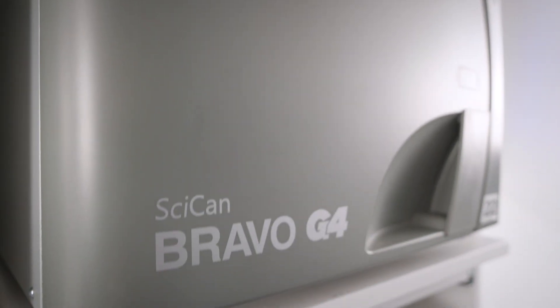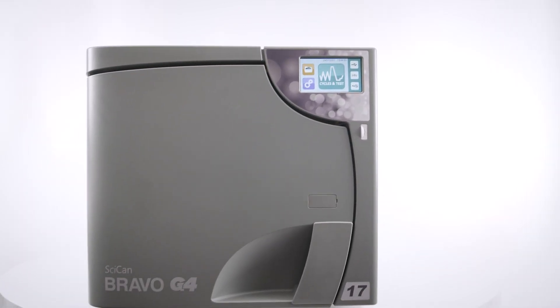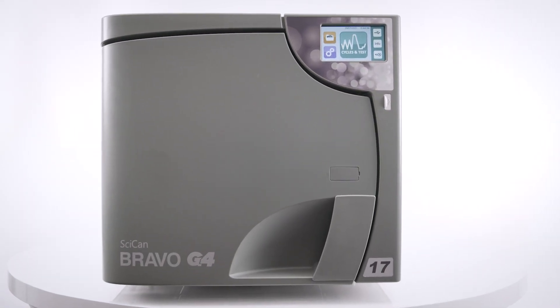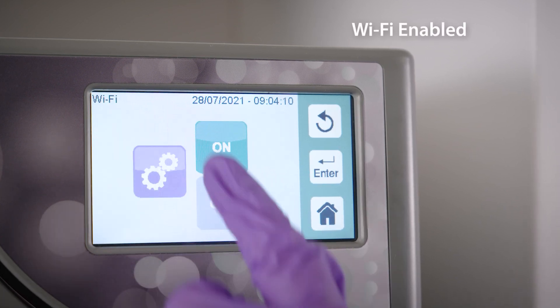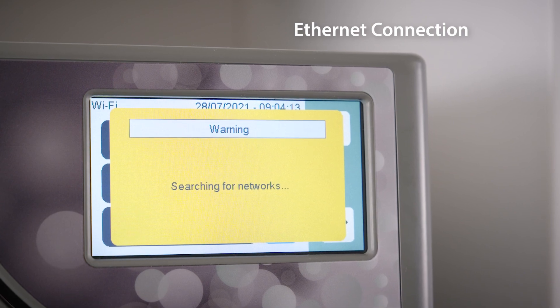If your Bravo G4 has not been connected to the G4 network, consult your operator's manual to register your unit using the cloud web portal activation code. Easily connect to the G4 network using a wireless network or Ethernet connection in a few simple steps.